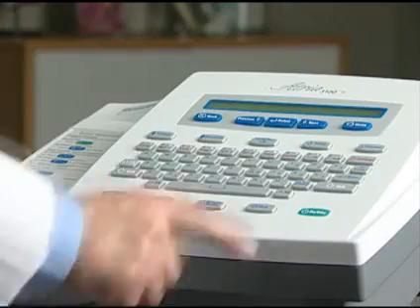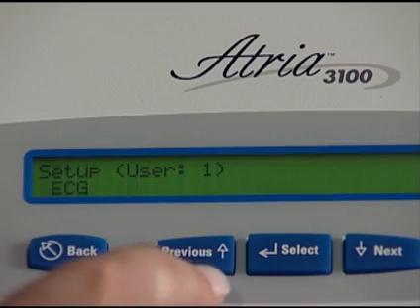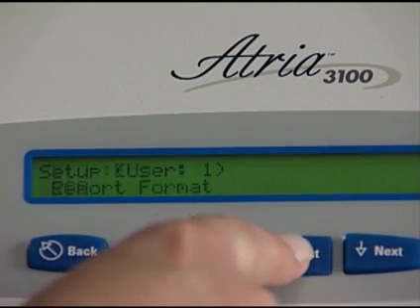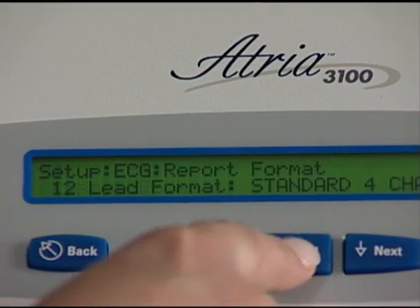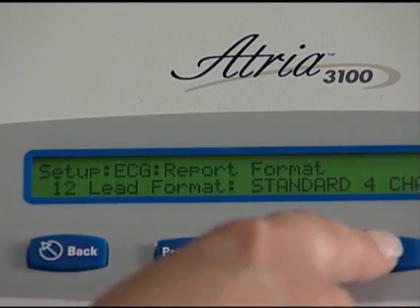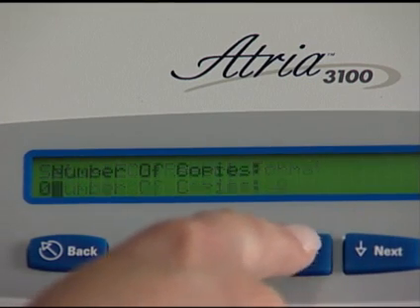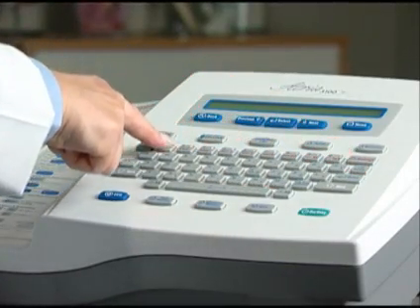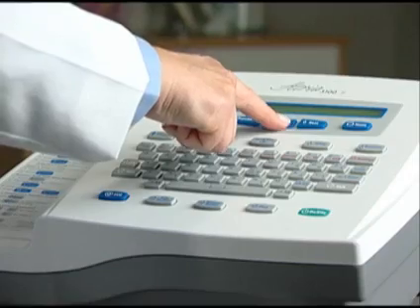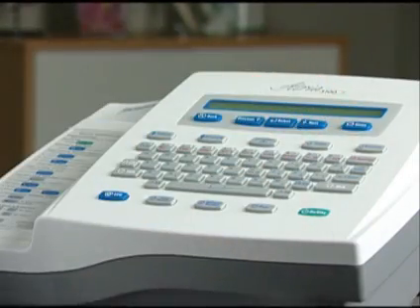Press Setup. Press Next and scroll until you see Setup ECG. Press Select. When you see Report Format, press Select. Use the Next key and scroll to Number of Copies. Press Select. Press Delete. Enter the number of copies you want, and press Select. Press Home to return to the main display.